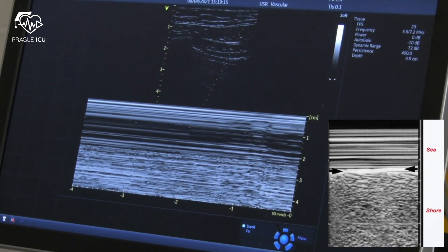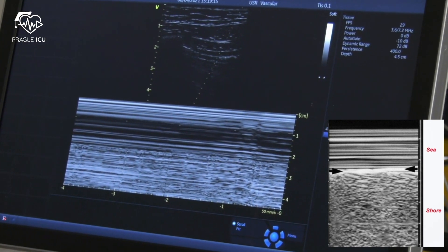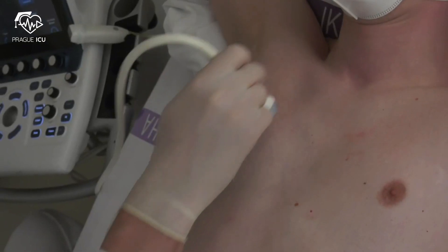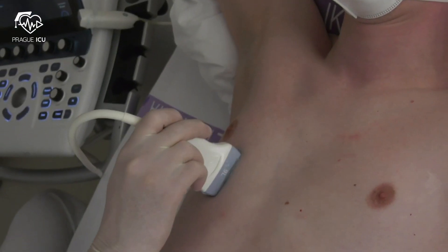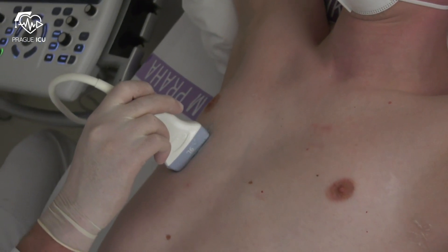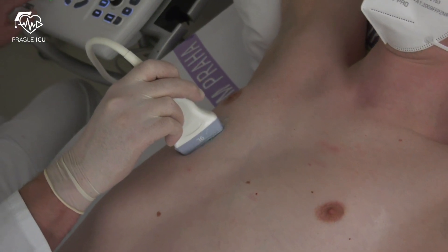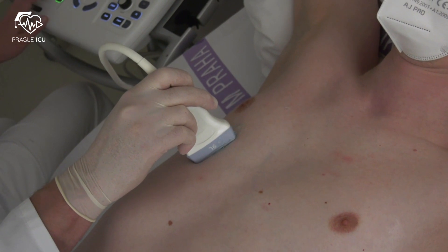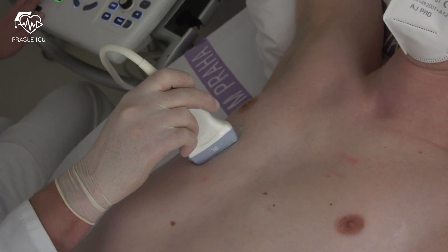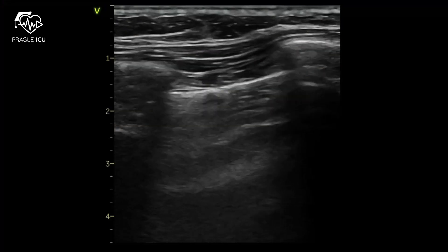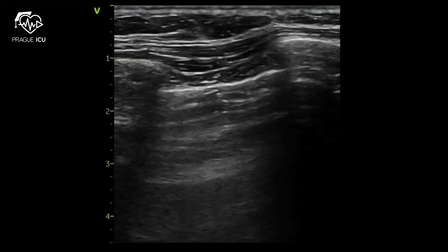We then continue with the same approach in other zones of the chest, looking for lung sliding. Lung sliding is detected in all areas.